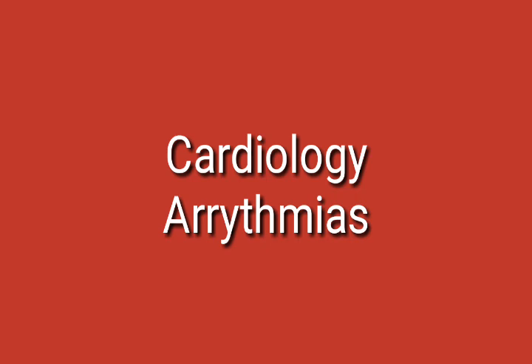Type 2 AV blocks involve some conducted P waves and some that are not conducted, and it's split up into two subtypes called Mobitz type 1 and Mobitz type 2. And then finally, a type 3 AV block is where there is no impulse conduction from the atria to the ventricles. So we'll go through these one at a time, and we'll start with first degree AV block.